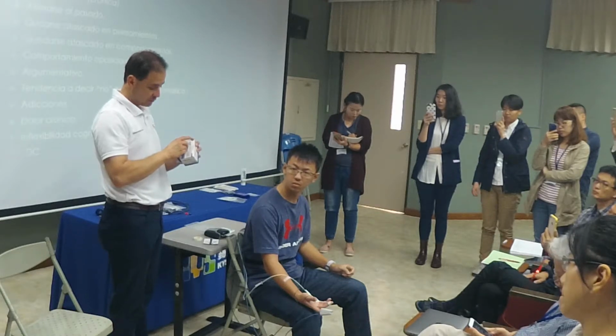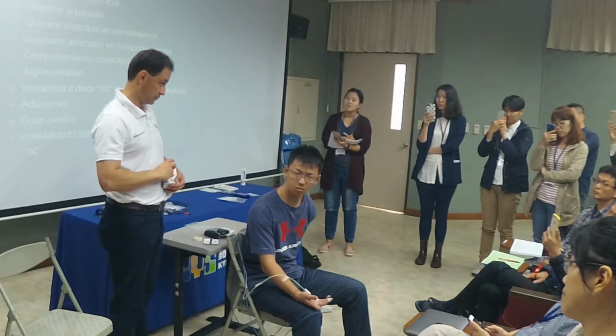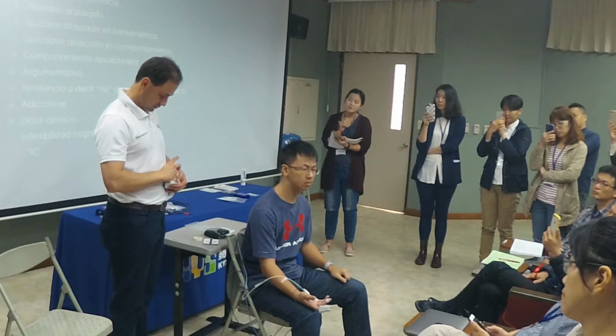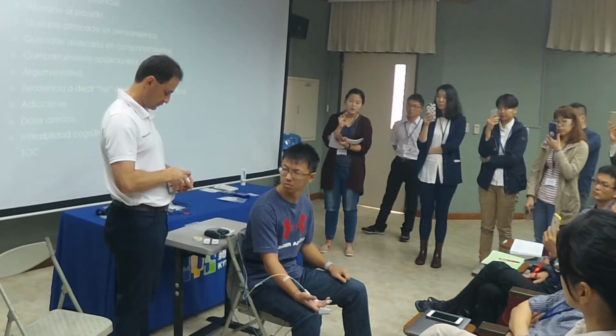Now, recommendation. You may know this, but it's a good reminder. Whatever you do, no matter what, do not make the client bleed. Okay? Because if they bleed, one, it is going to be uncomfortable and awkward, and two, you're entering in contact with body fluids. So you got HIV, hepatitis, all those things. Now, normally the skin here, unless you scrub really hard, you're not going to make it bleed. But when you do the scalp for neurofeedback, be very careful with that, please.